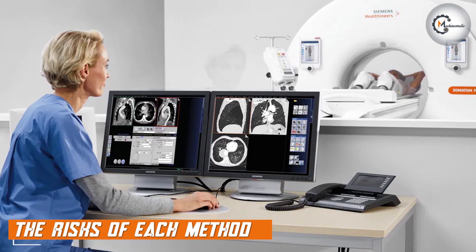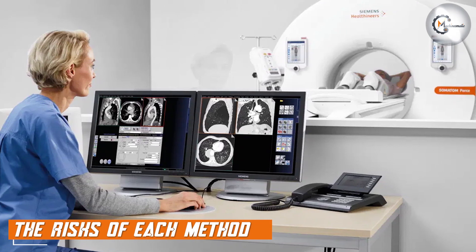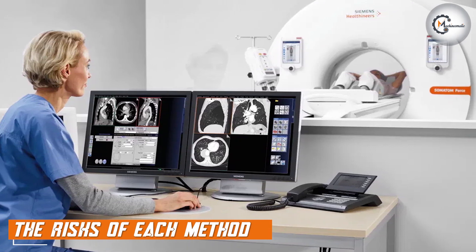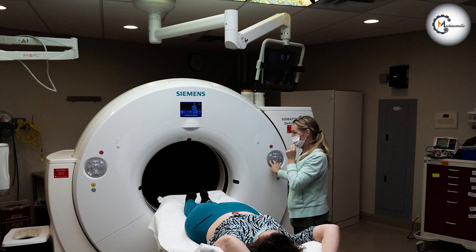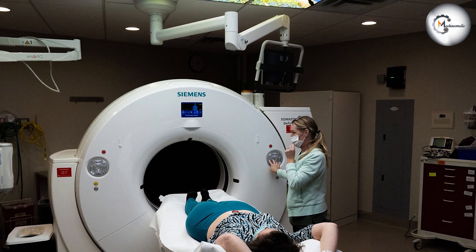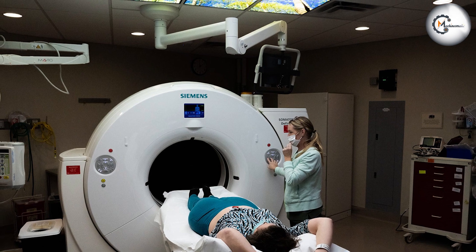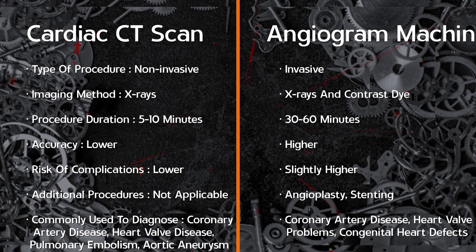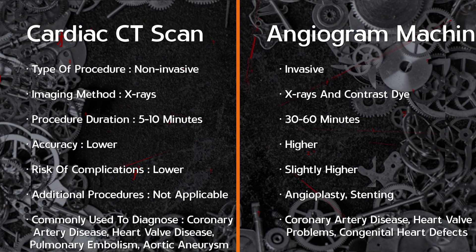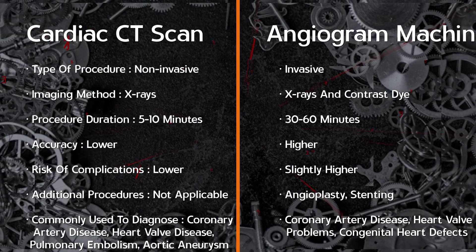As with any medical procedure, both the cardiac CT scan and the angiogram machine come with some risks. With the cardiac CT scan, there is a small risk of radiation exposure, which can increase the risk of cancer over time. However, the amount of radiation used in a cardiac CT scan is relatively low, and the benefits of the procedure usually outweigh the risks.